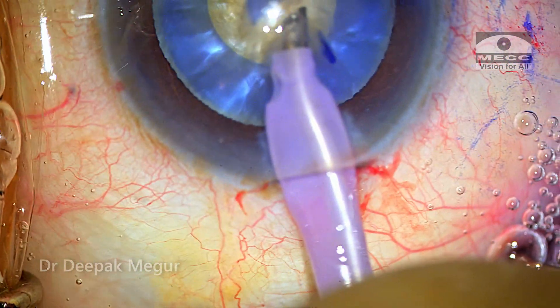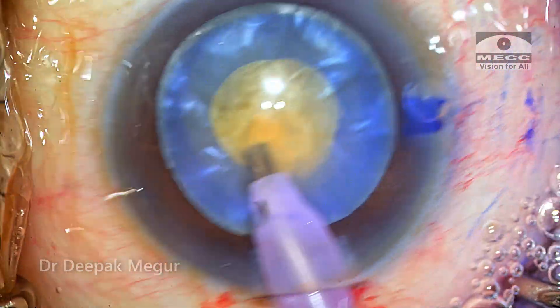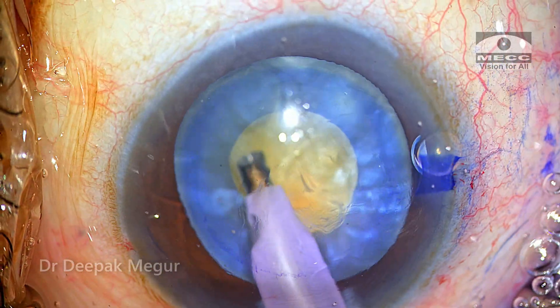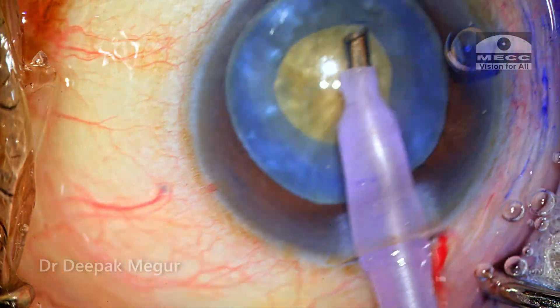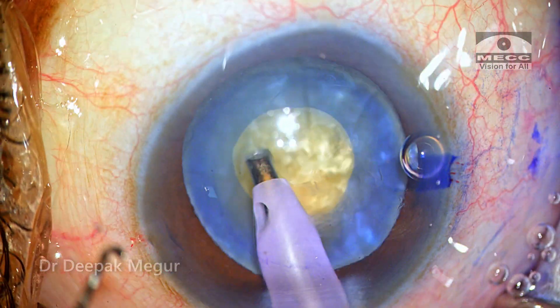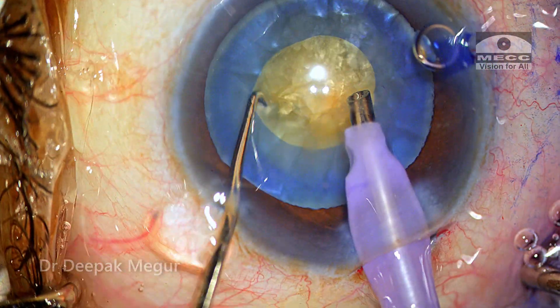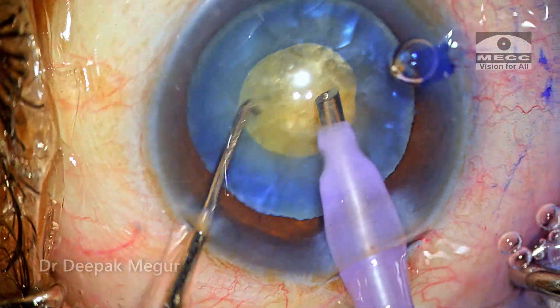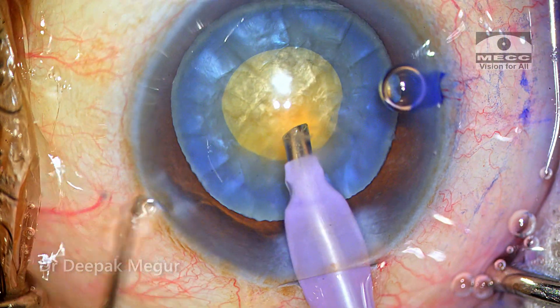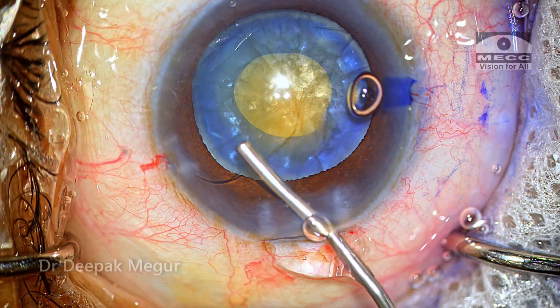Now I need to decompress the bag by aspirating the swollen cortex both in front and behind the nucleus. I prefer to use the phaco probe itself to aspirate this material because the swollen cortex is like jelly and the smaller I/A probe might not be very efficient. I tap the nucleus with the phaco probe, try to rotate it, loosen the cortex, and then aspirate the thick cortex. Using a syringe through the side port helps loosen all the cortex, and some cortex behind the nucleus flows across the equator and can be aspirated, although it is difficult to reach the equatorial portion of the bag. Once the decompression of the bag is reasonably good, I stop and fill the chamber again with dispersive OVD.